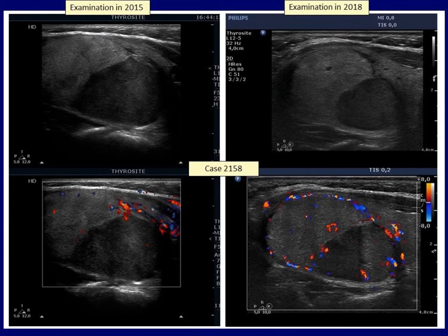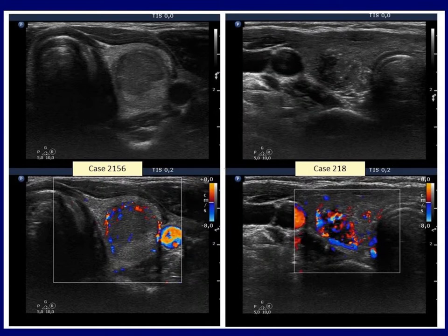The distribution of intranodular flow was irregular in this follicular adenoma, which also showed perinodular vascularity. In the next case, cytology resulted in a benign lesion. Note that the vascular pattern should be classified differently at the two examinations: in the first, perinodular flow was observed in less than 25% of circumference, while at the later visit the degree was above 25%. Comparing a benign follicular adenoma to a papillary cancer, both showed perinodular and intranodular flow, but they differ in the degree and distribution of intranodular blood flow — the papillary cancer presents more increased and irregularly distributed intranodular flow.